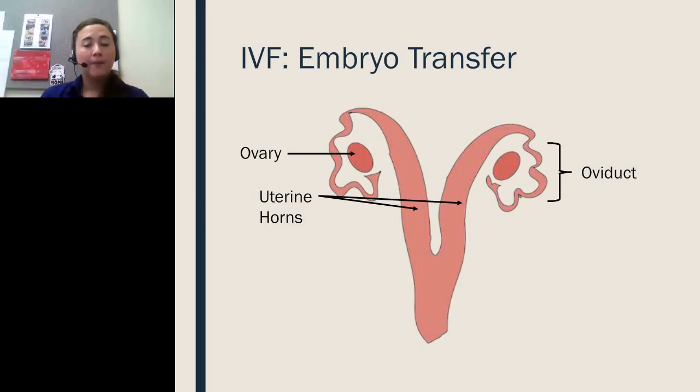In the dog, embryos do not actually migrate into the uterine horns until about day 11 post-LH surge, when they're at the 16-cell morula stage. So we had primarily 4-cell embryos, which were day 8 post-LH surge after the whole collection and IVF procedure. They should be in the oviduct at this time, but it's difficult to get them there.